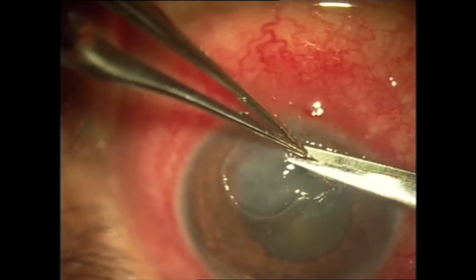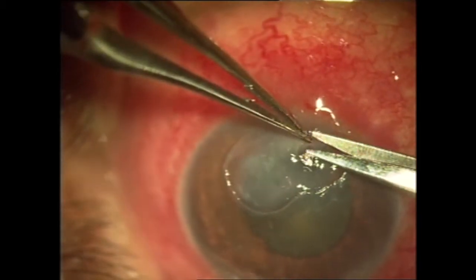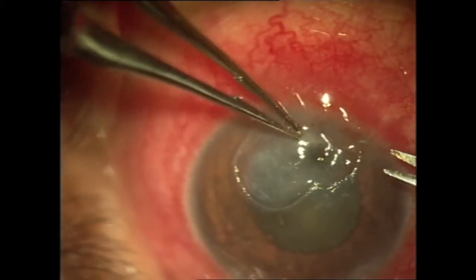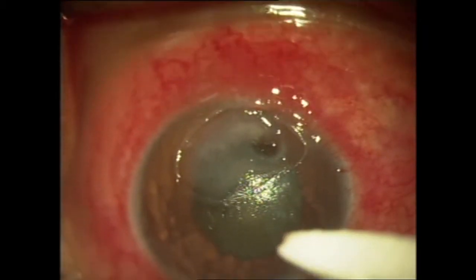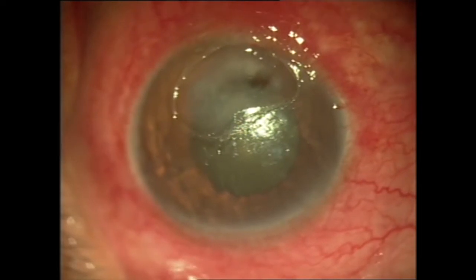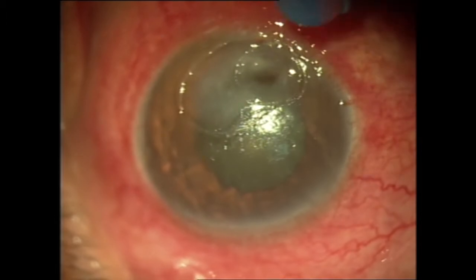Care should be taken not to create a perforation or, in case of a perforated cornea, not to enlarge the area of perforation. The surface is then dried to the maximum before glue application. Glue is loaded in a 1 cc syringe and then applied to the ulcerated area.